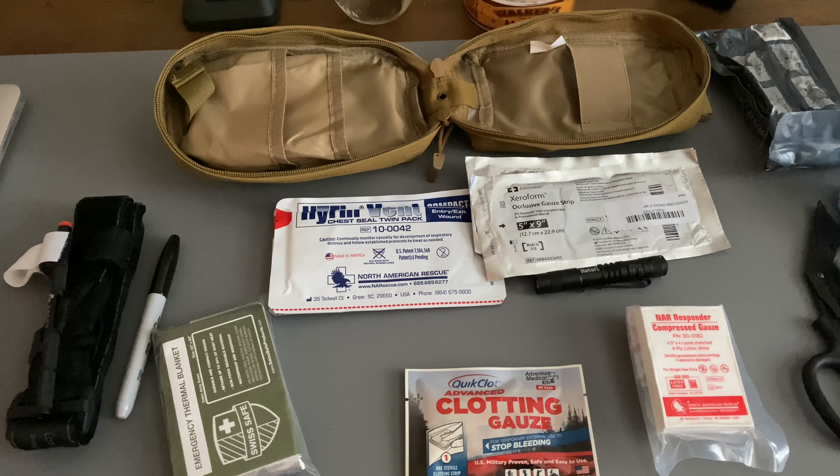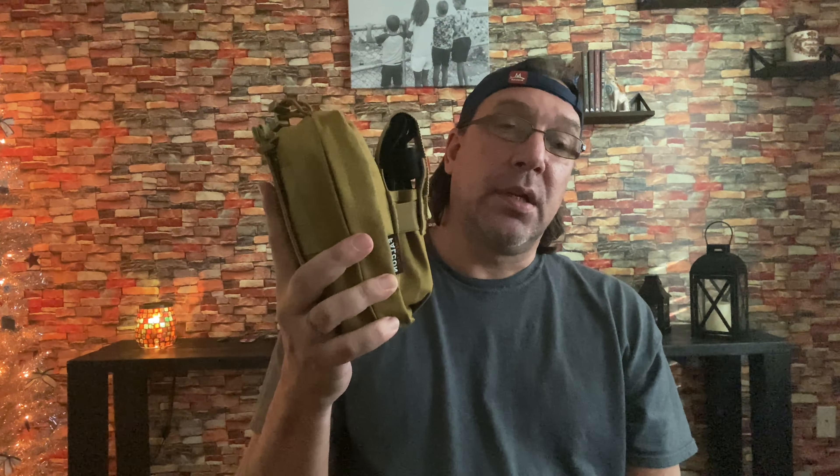So there you have it guys — that is what I thought would make up a pretty good trauma kit. That was the trauma kit I put together. The clotting gauze I might go with something a little better at a later date. Like I said, I was just trying to keep costs down a little bit. Most of the stuff in there is pretty good. I thought that was going to be a bigger package — it wasn't — so I may go with something else later. But that's the trauma pack, and it's going on my new bag for starting out the year.